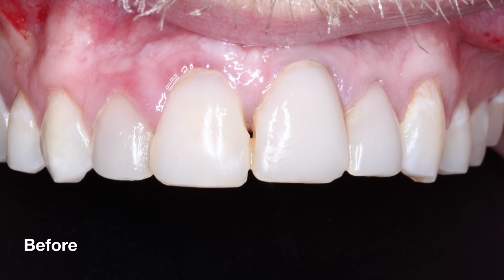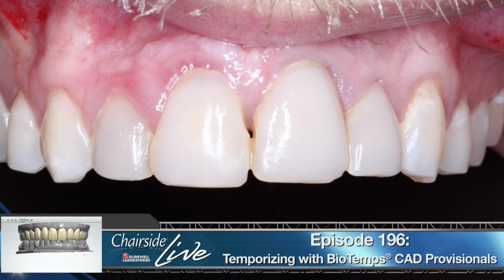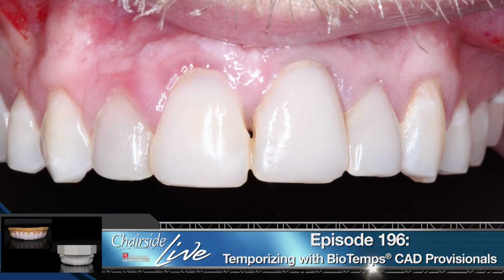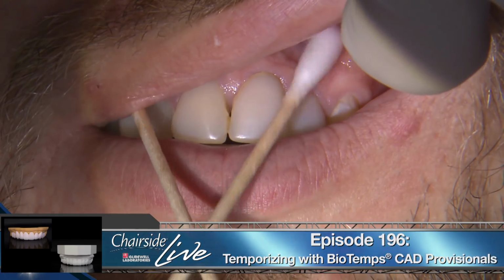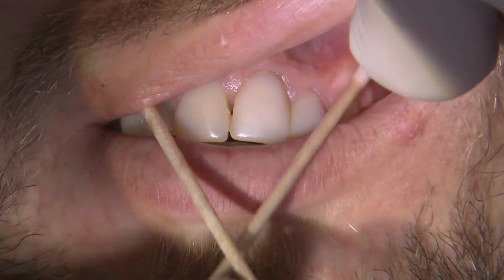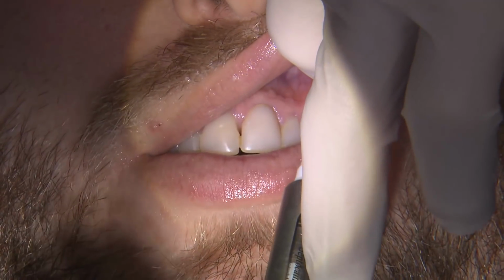Before the prep appointment, I sent impressions to our fix department where they designed a digital diagnostic wax-up to help us on the clinical side know if there are any possible limitations. Once the designs are approved, they then send the digital designs to the biotemps department to fabricate provisionals from those final designs. You can hear Dr. Murashan explain this process in more detail in episode 196. We will now begin the procedure with local infiltrations to ensure our patient is comfortable.